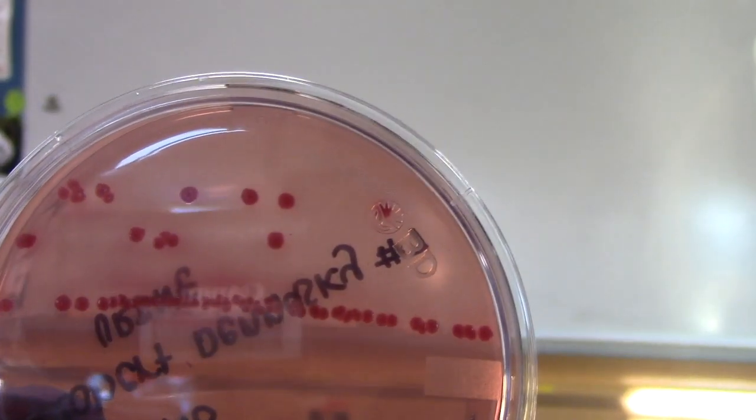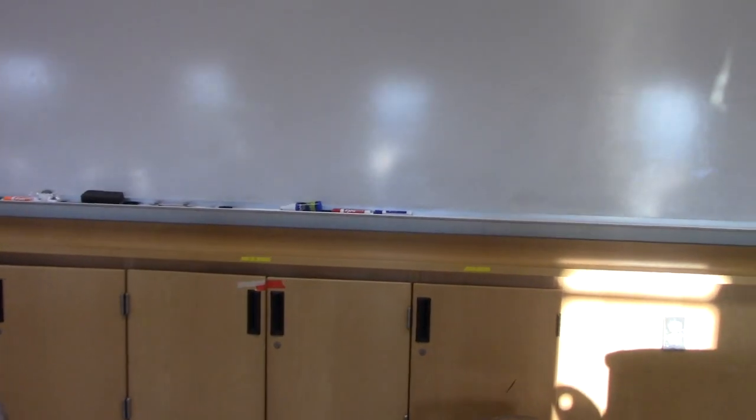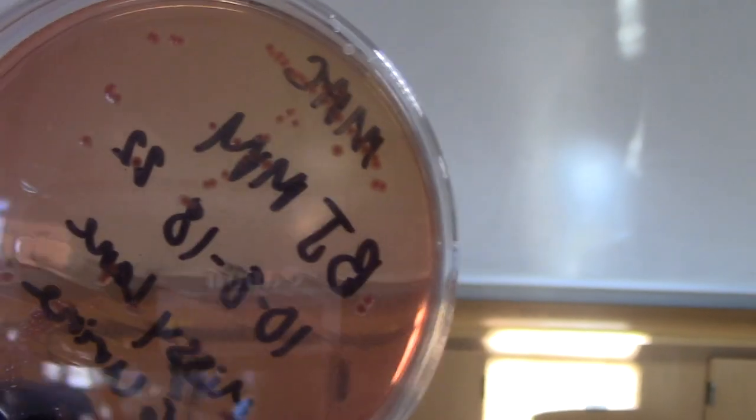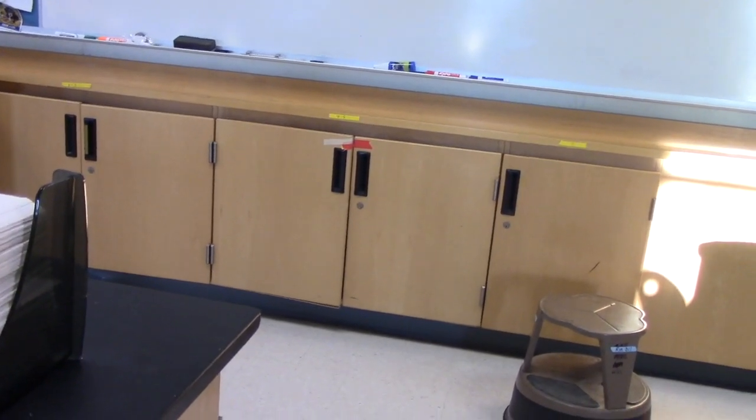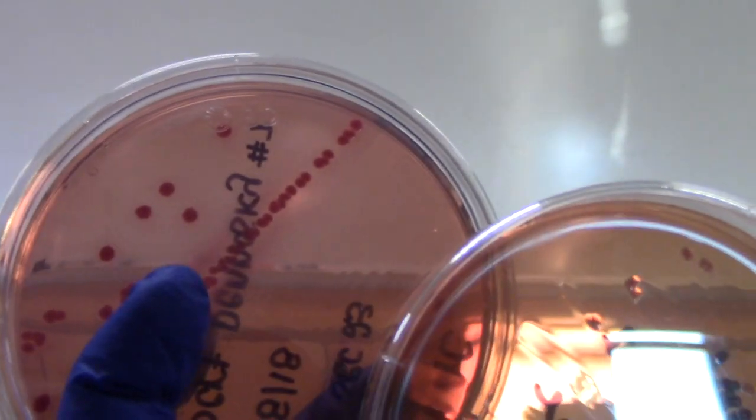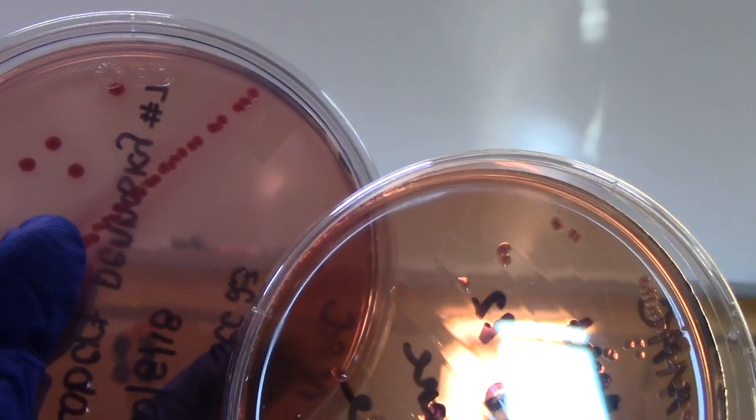If we look at these against a light background, we can see that the non-lactose fermenter has tannish colonies, maybe with a slightly pink center, and the lactose fermenter has dark pink or purple colonies, as we can see in this comparison.